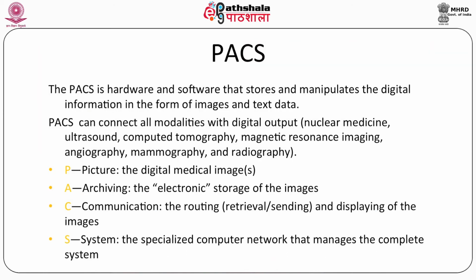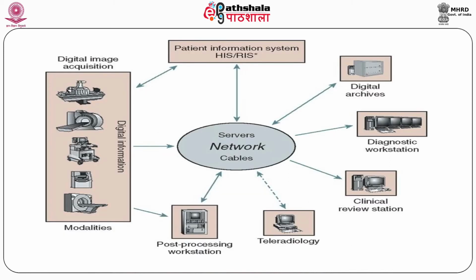Now coming to PACS, the picture archiving and communication system. PACS is hardware and software that stores and manipulates digital information in the form of images and text data, as shown in the figure. You can see here that once the data is recorded, it can be processed, and after processing it can be sent locally.